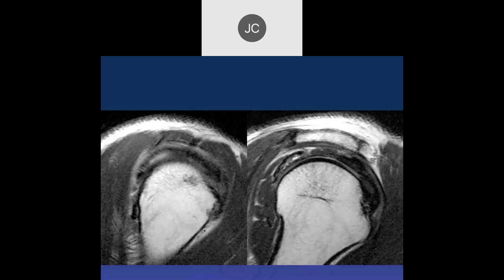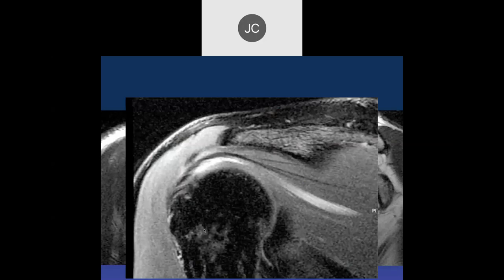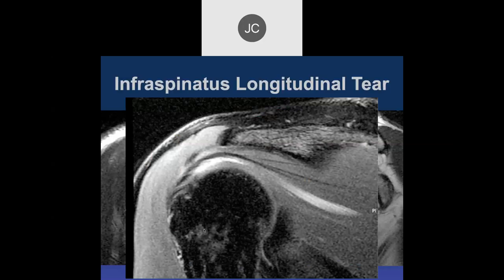Sagittal views looking at the infraspinatus: some increased signal on the T2. It looks interstitial — increased signal within, with possible atrophy in the muscle or fluid. On PD fat-sat it looks like fluid extending into the muscle. These pretty commonly involve the infraspinatus as well — same partial tear into the joint space and a longitudinal tear back into the muscle.